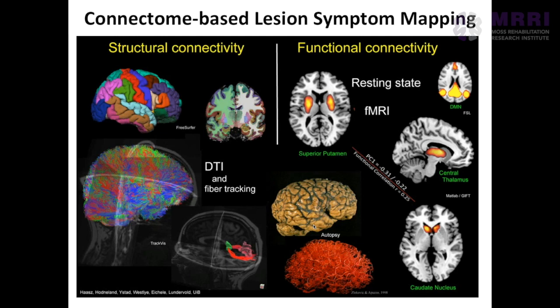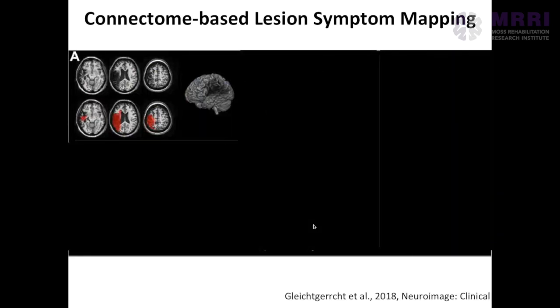and using the same kind of multivariate approach to understand, instead of just looking at two individual regions, you can look at a whole connectome-wide amount of disconnection, and you can use SVR to pull out those disconnection patterns, the edges, so the disconnection between regions that are most predictive of your behavior, like we've talked about with lesion symptom mapping, okay? So in that case, it's with voxels. In this case, we're going to talk about a connectome, okay?